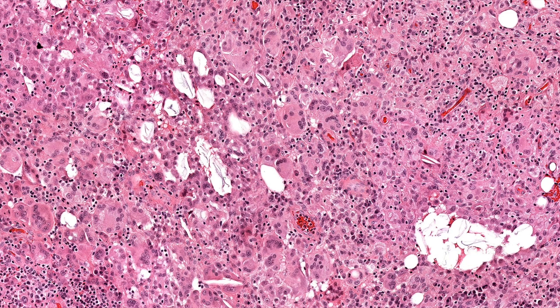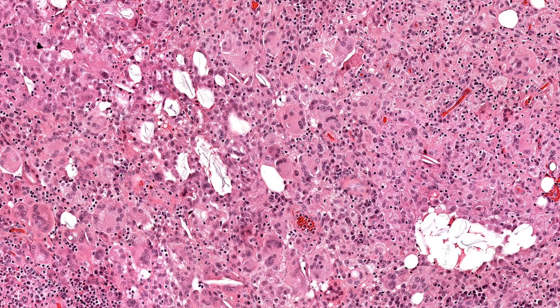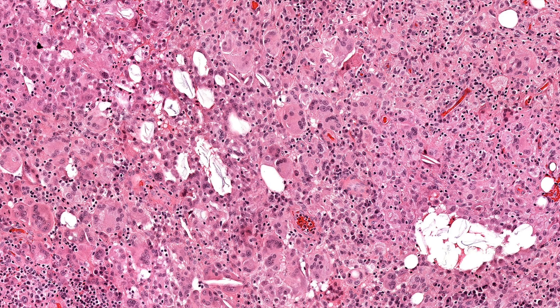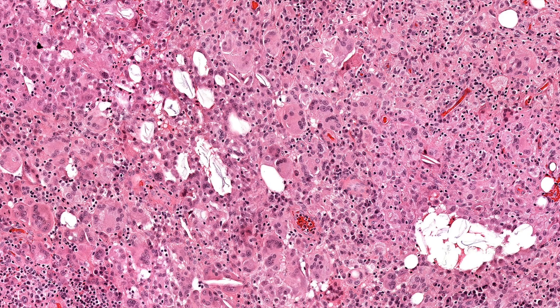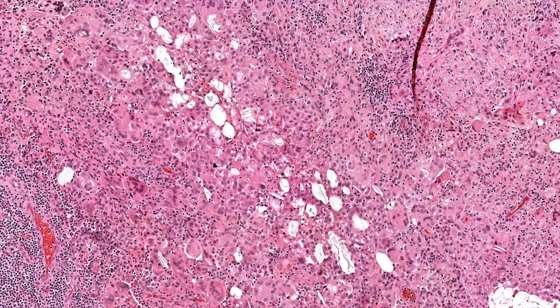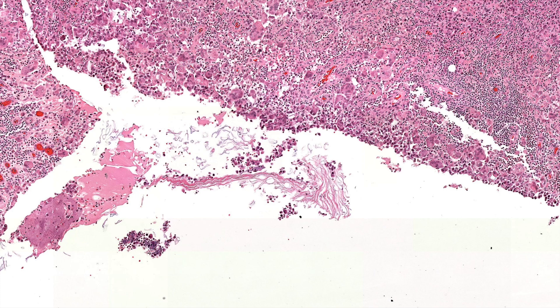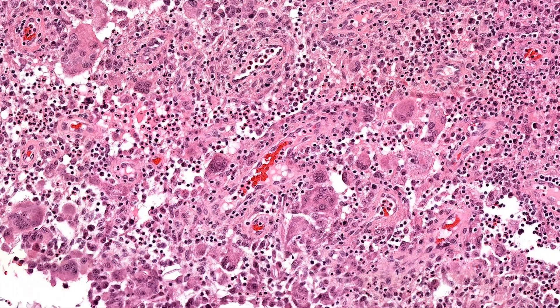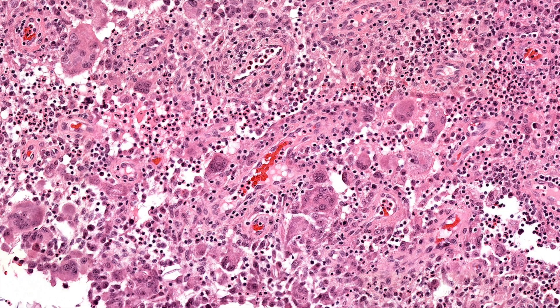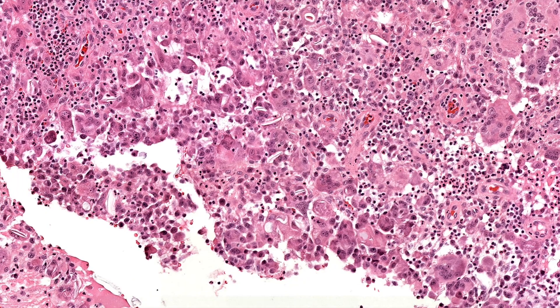The mixture of findings is not very specific — the key is finding the keratin flakes, which sometimes can be very rare and focal. Usually you can see them on H&E if you look carefully; I've occasionally even done a keratin stain because I thought something might be keratin but wasn't sure, and the differential was infection or something else. If I take away all the keratin and I've got granulation tissue, granulomas — especially with a lot of neutrophils — then our biggest differential is infection, like fungal infection or an abscess, because granulomas and neutrophils means infection until you prove otherwise.